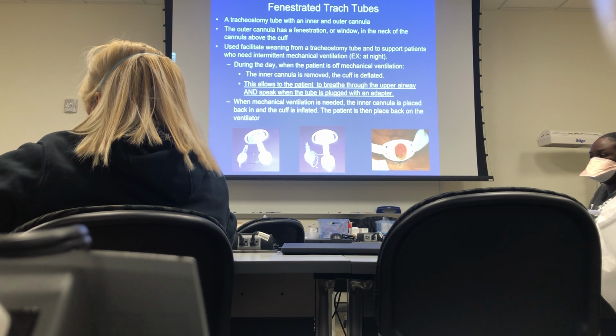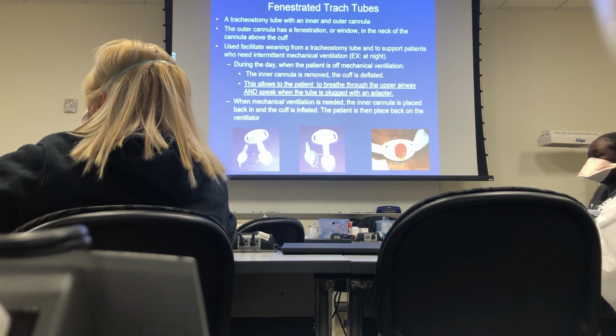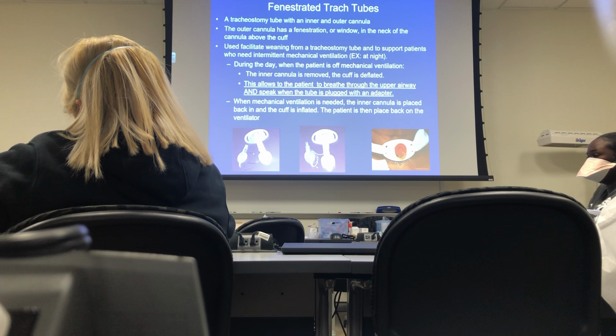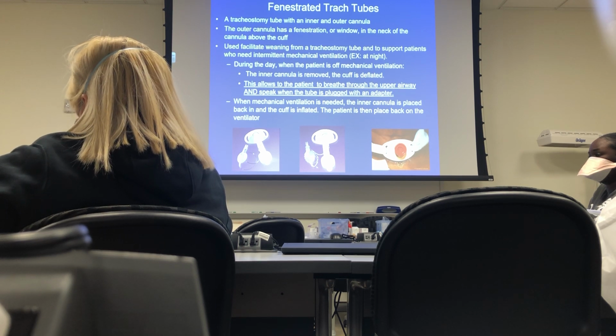So if the cuff was up and the plug was in, when they went to breathe in, where would the air go? Through the mouth? No. They can't get around the cuff. Oh, yeah. They wouldn't be able to breathe. So it's a stepwise fashion. You suction the trach and suction out the mouth. You deflate the cuff. So you suction first so that when you deflate the cuff, all the secretions don't go down, right? So you suction, you deflate the cuff, you take the inner cannula out, and then you plug the trach.